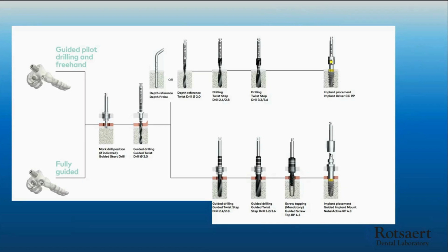Okay. The alternative to that is when we do fully guided, we then have sleeves that are large enough in the surgical template where the implant can pass through. So why do we do that? Well, while using a series of what they call drill guides or spoons, depending on the seminars you may be in, there are different terms that people use, but it's really called a drill guide and a drill key, where it fits into those sleeves.